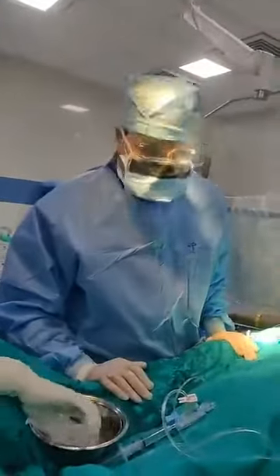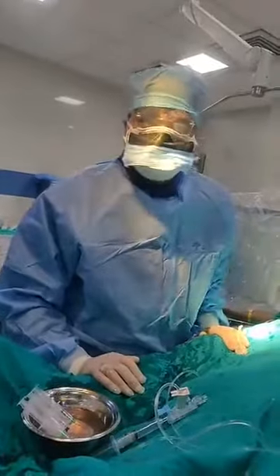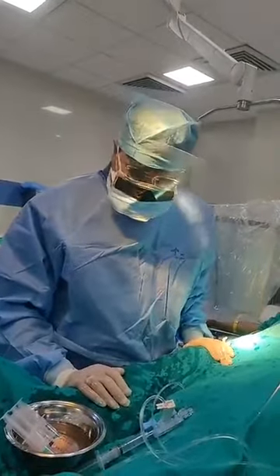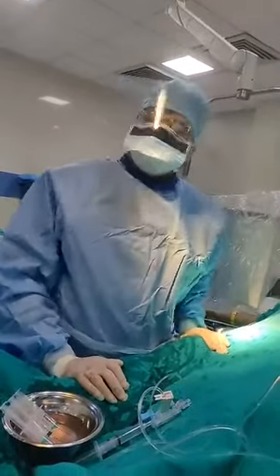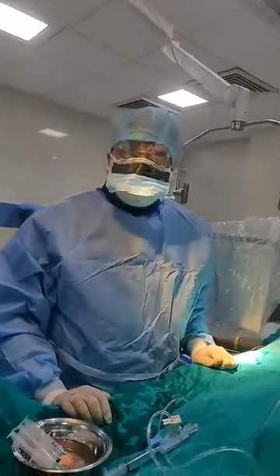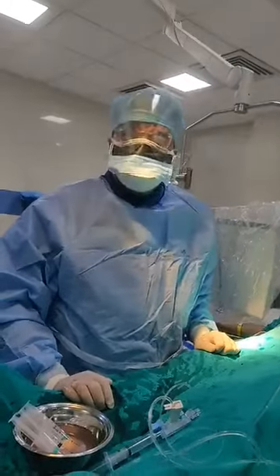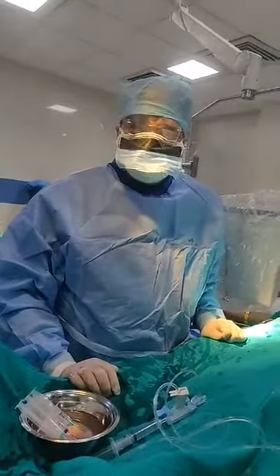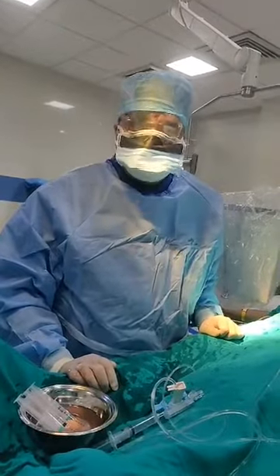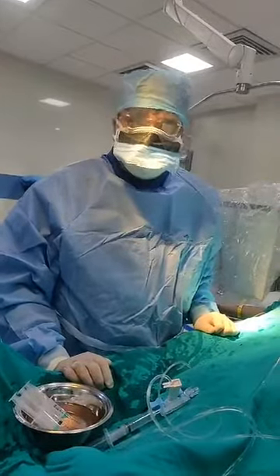I am Prof. Dr. Vivek Gupta. This is Facebook live and today is 27th of June. You are seeing that we are in something like an operation theatre, but actually this is not an operation theatre — this is a cath lab, a cardiac catheterization lab where we routinely perform coronary angiography. This angiography is a normal test for all patients who have had a heart attack, angina, or any heart disease.